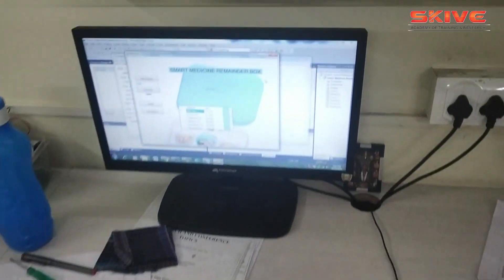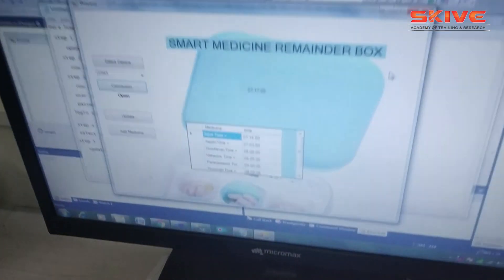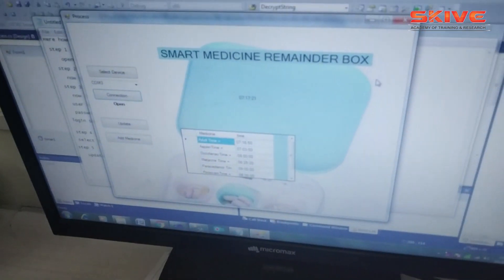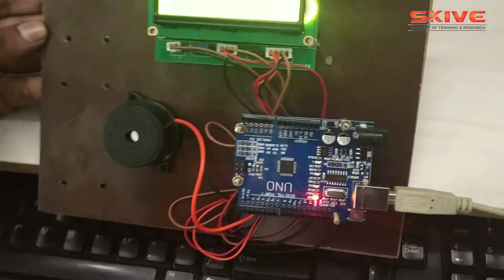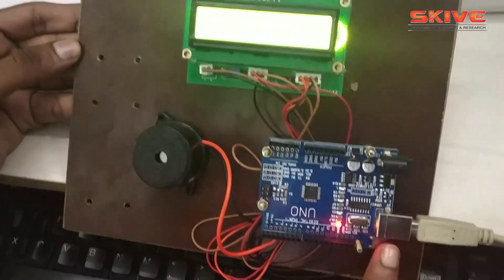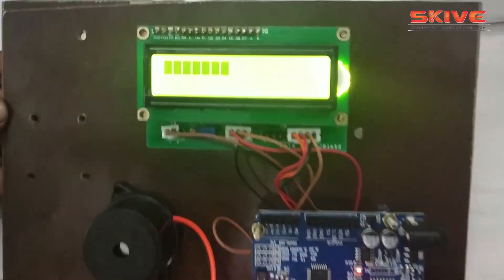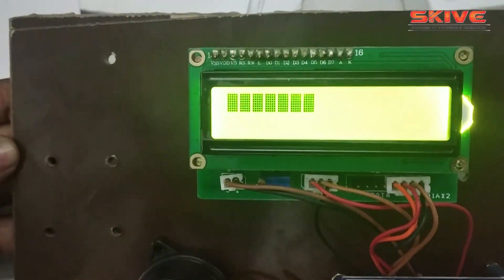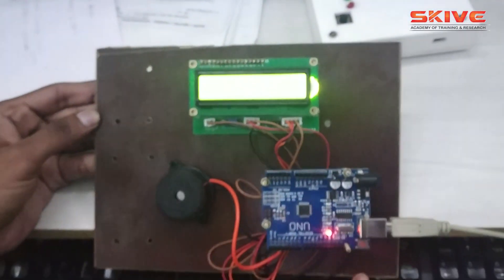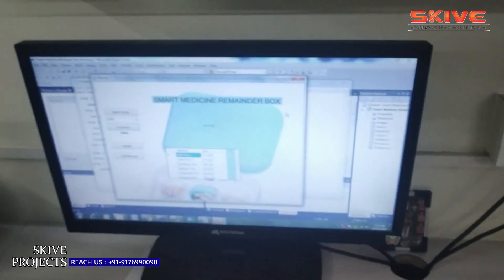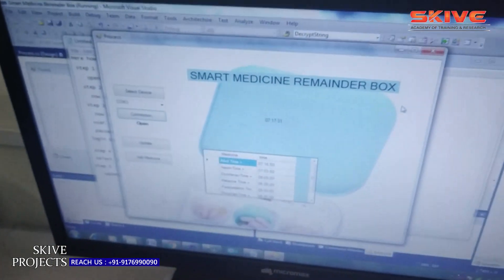Hello guys, today we are going to see a project demonstration of a smart medicine reminder box. This is a hardware and software based project. It contains an Arduino board, LCD display, and buzzer, along with a software section.